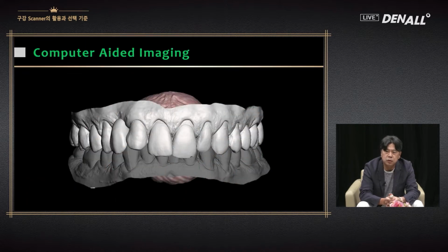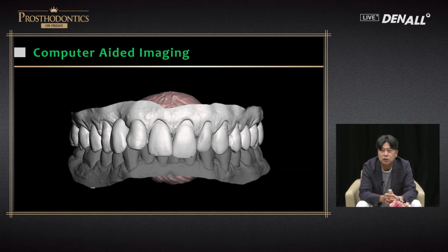Through the intraoral scanner, as you can see, we can obtain the data through the software. The data can be received and processed. CAD/CAM is computer-aided design and computer-aided manufacturing. Just like that, we use the term CAI, which stands for computer-aided imaging. These days, young people use Photoshop. When they take pictures using a selfie, they transform the pictures taken, and they don't stand just looking at their bare face. To do so, we need to take a picture first. After that, processing can be done.